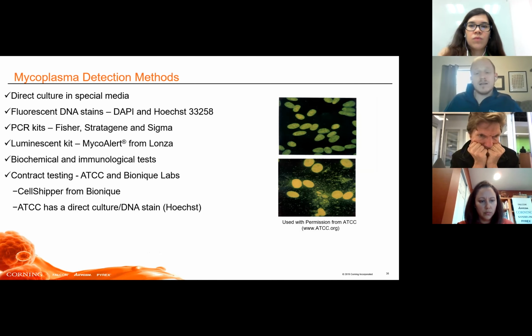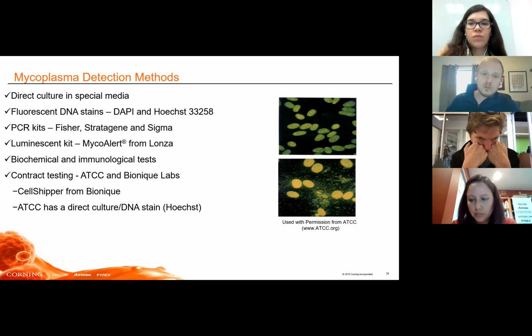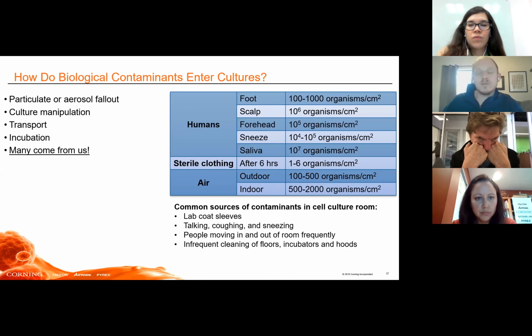But it's something that many people already have, Mycoplasma contaminating their cell cultures, and you don't realize it until you do some kind of biological study and the cells are not behaving like they're supposed to. And oftentimes that's when you go down the rabbit hole and determine that it's due to Mycoplasma. So I strongly recommend testing routinely for that.